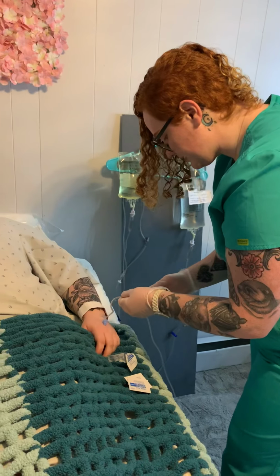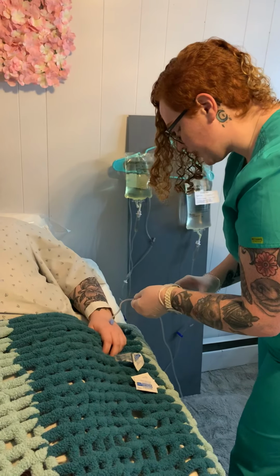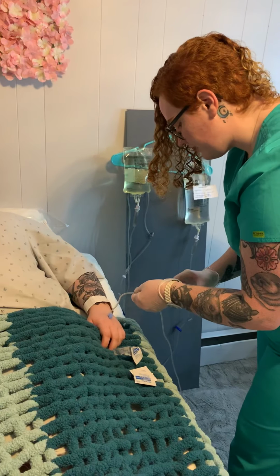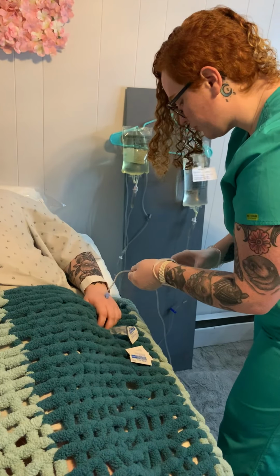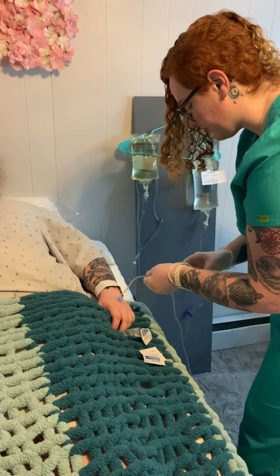I will pinch this and inject 2 mL while looking at the IV site, pull back for aspiration of blood, and then push in the last remaining 8 mL of the medication.